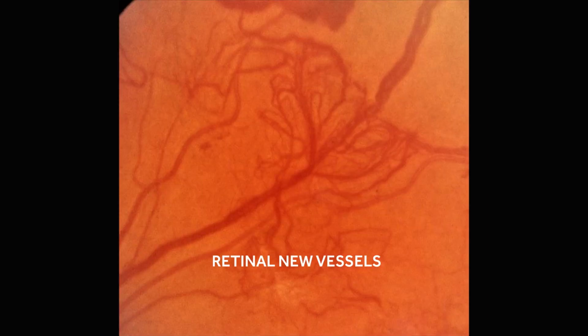The direct ophthalmoscope allows the examiner to gather much information about the health of the eyes. As ever, it is important to achieve the best environment for the examination and to proceed in a systematic manner.